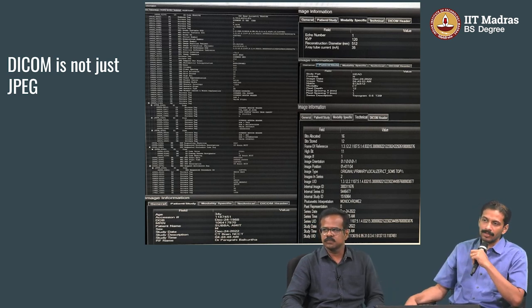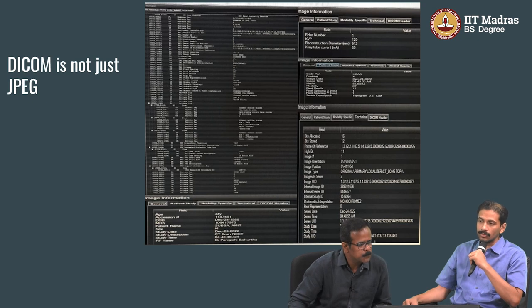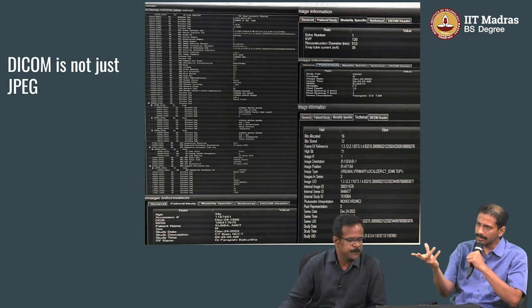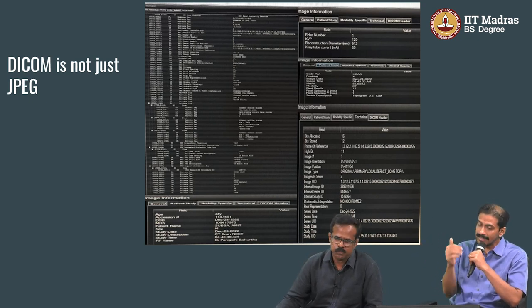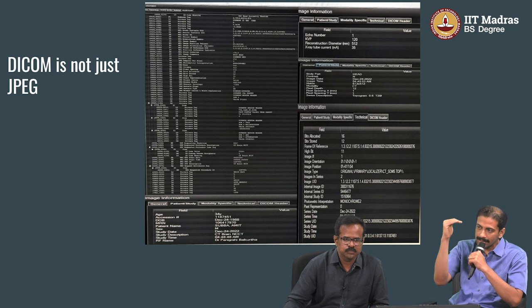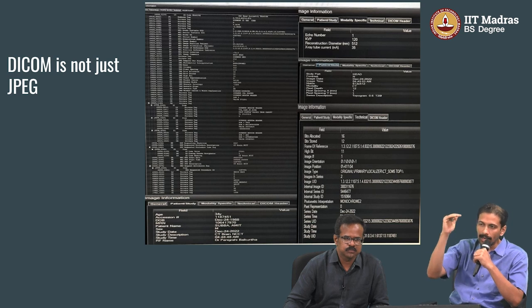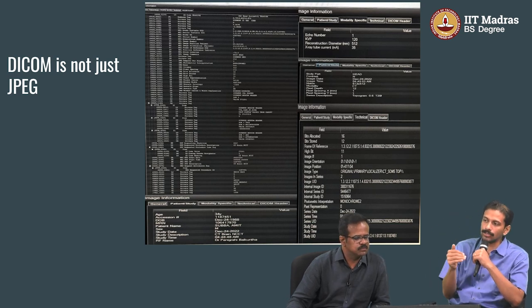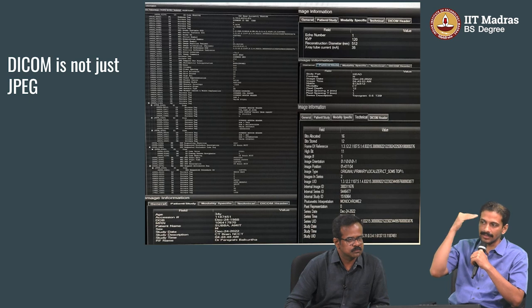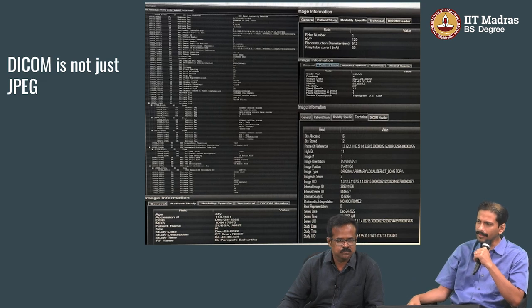It depends. For example, a radiograph will have 2K, 3K resolution, so accordingly the bit depth will be around 14 bits. You can approximately calculate the size. It will be around 5 to 6 MB maybe. CT scan images are traditionally lower resolution. Although CT gives more information than X-ray, as a single image, there can be 500 slices over an entire stack, but an individual slice has a lower resolution compared to X-rays. For example, 512 is the standard matrix size of a slice. 512 by 512 with 14-bit depth will be roughly 400 KB.